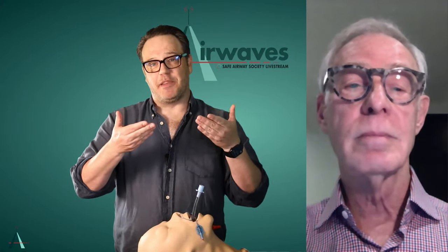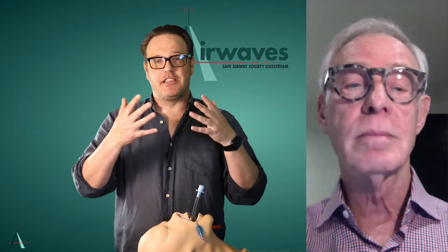Now, one final troubleshooting thing that I went through with you when I was learning this technique was the problem, because you're keeping the tip back from the vallecula, in someone with a large floppy epiglottis, the epiglottis flopping down and just obstructing my view, and your solution to that was incredibly simple.